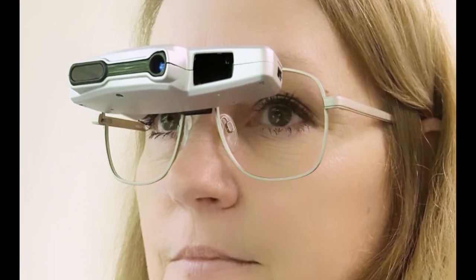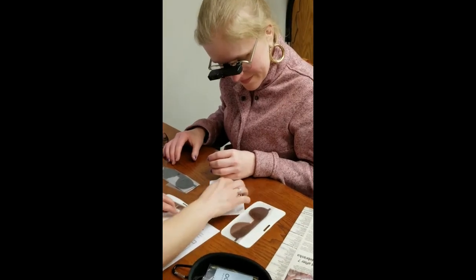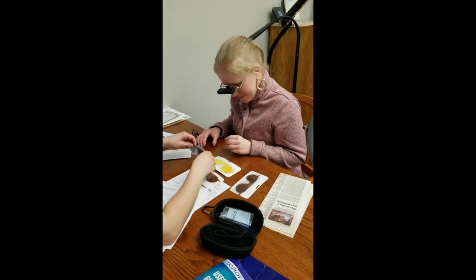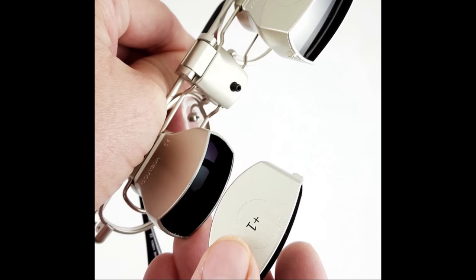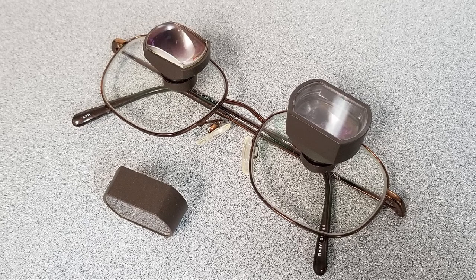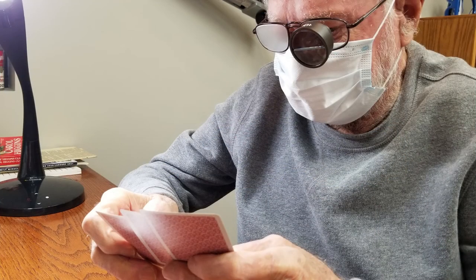Next would be bioptic telescopic glasses — that could be autofocus such as the Ocutec Falcon, it could be focusable which a few companies make, and it could also be fixed focus where you would place a cap on the lens. A patient might have a fixed-focus bioptic for driving, but through the use of a cap placed on the lens it could refocus them to a distance on the table. I've actually prescribed that for Texas Hold'em players at casinos and it works quite nicely. Next would be a full-diameter telescopic pair of glasses that the patient has for television or other distance uses — they could place a bifocal or a split cap on that lens, and here you'll see an example of that.